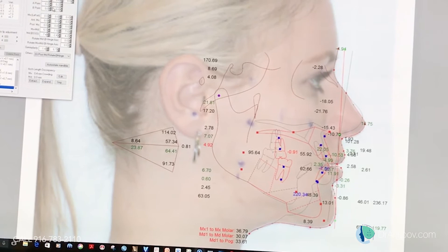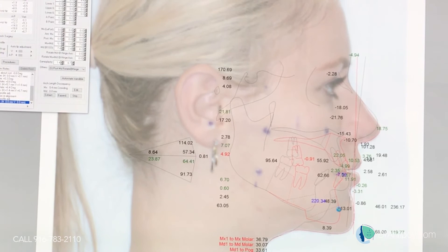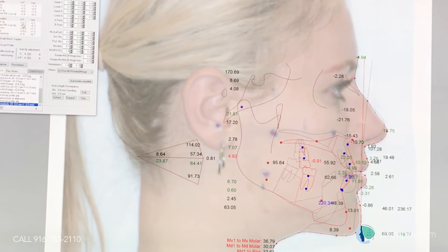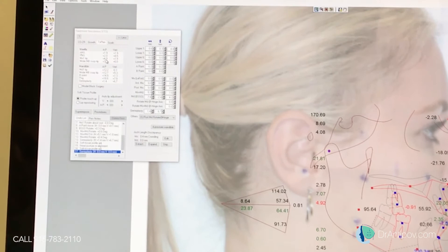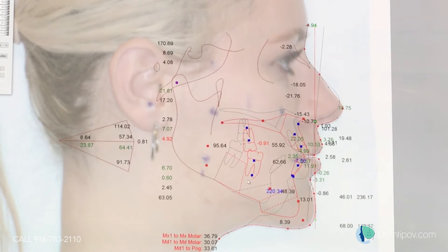Looking at the numbers, we're at almost 20mm at the chin movement, so we have to lengthen the chin. Lengthening is about 8mm - that's what we need. Our incisal edge went 5mm forward, which is not much, and Pogonium came forward. So it's quite a big advancement of the soft tissue.